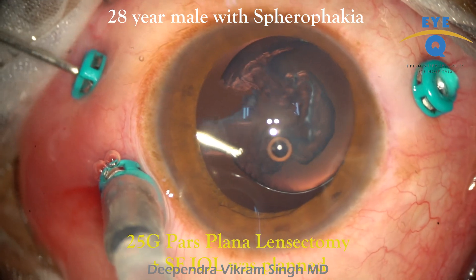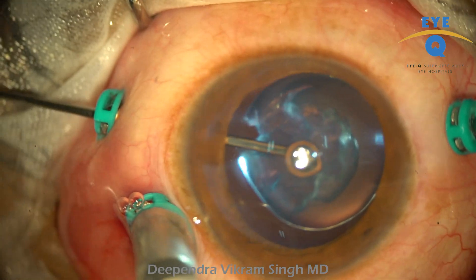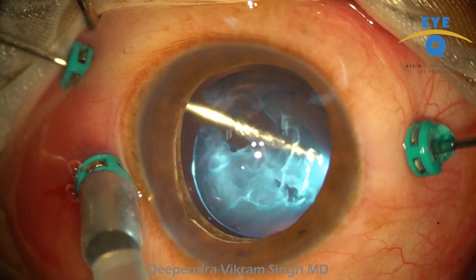This was a 28-year-old male with spherophakia in both eyes. Pars plana clear lens lensectomy with scleral fixation of a three-piece IOL was planned.